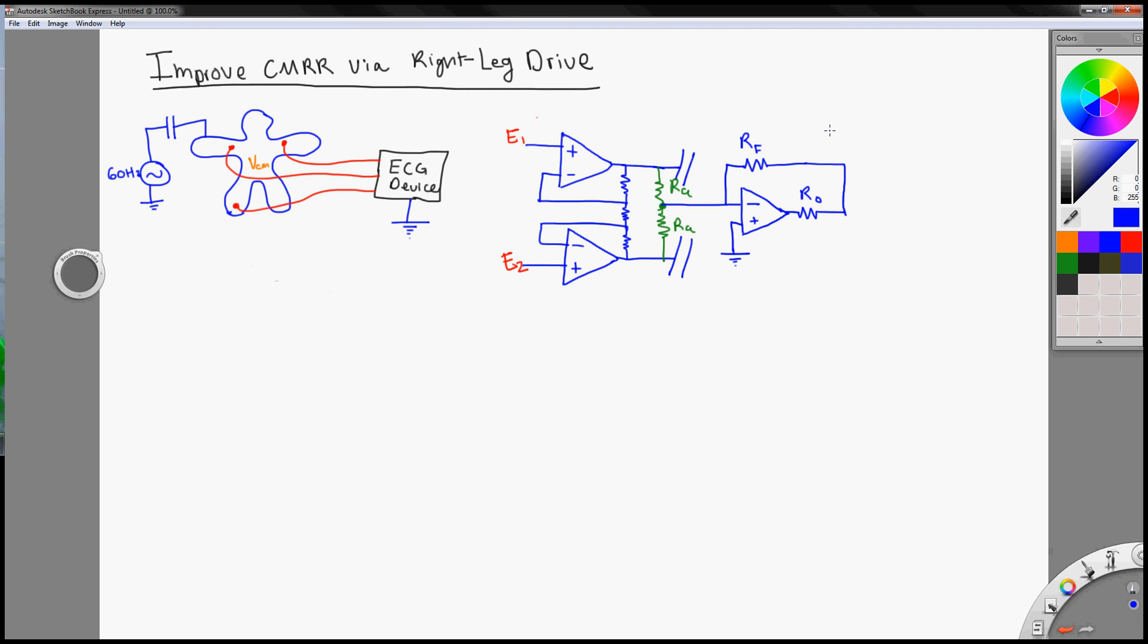So this is the right leg circuit right here. This will be connected to the patient's right leg, and then we can model the resistance called R right leg, and hence that's where the name right leg drive comes from.